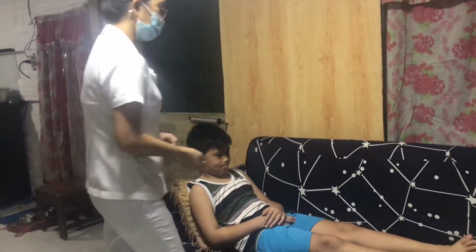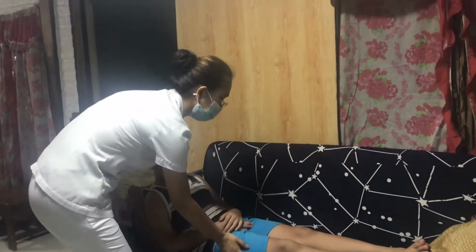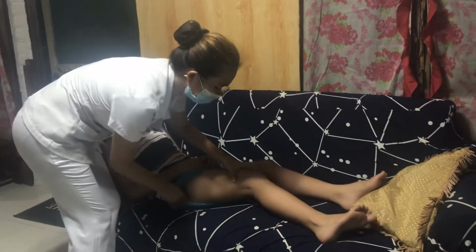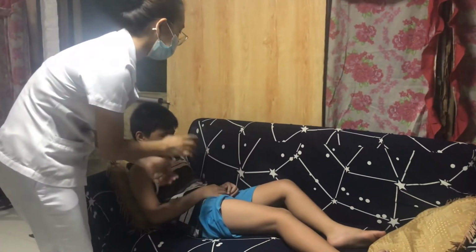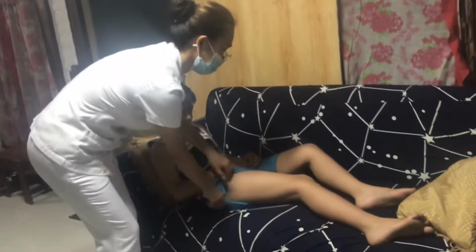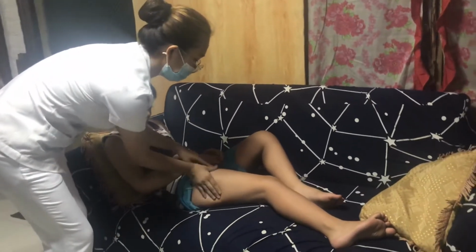Alright, sir, hello. I will be performing the medication again through your vastus lateralis. Can you expose this part, sir? And I will be palpating this part, sir. I'll be just inspecting if there's any lesion, edema, or any bruises. Okay. I will be palpating this.